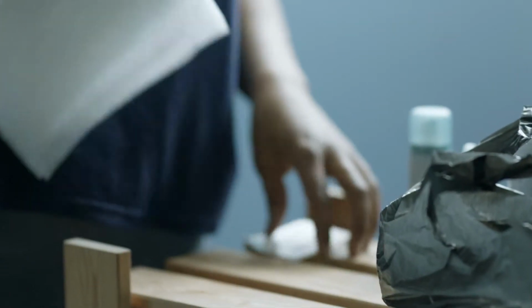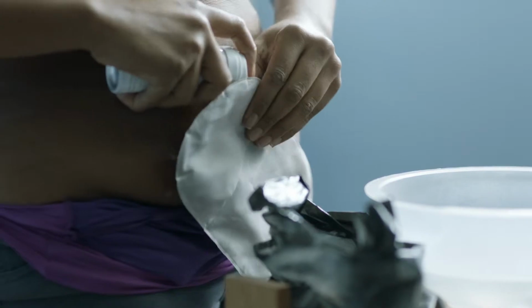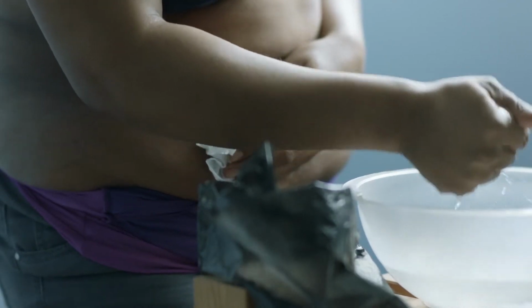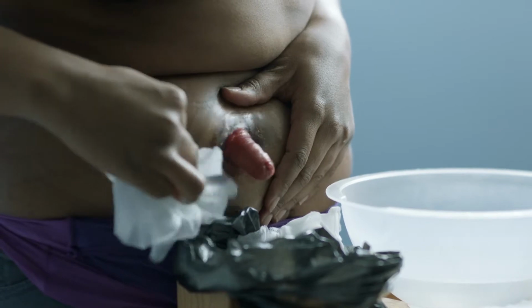I then make sure that I have my dry wipes. I make sure that I have my ostomy removal spray. I then use the adhesive removal spray to remove my ostomy bag. And I then wash around the area to make sure I get all of the old adhesive from the mouldable ring that I had on before, make sure it's completely clean and that my skin is completely clear.